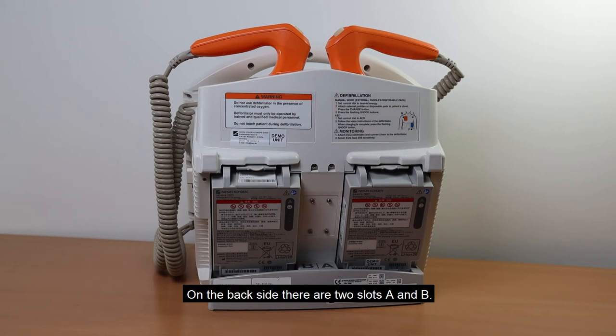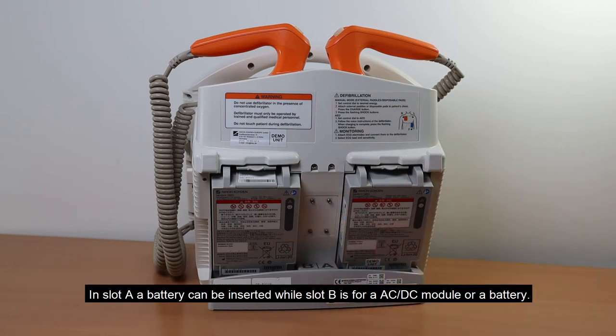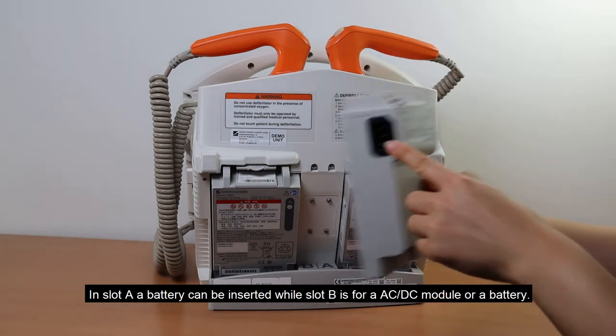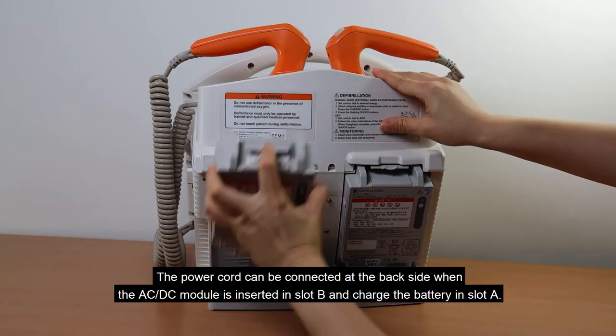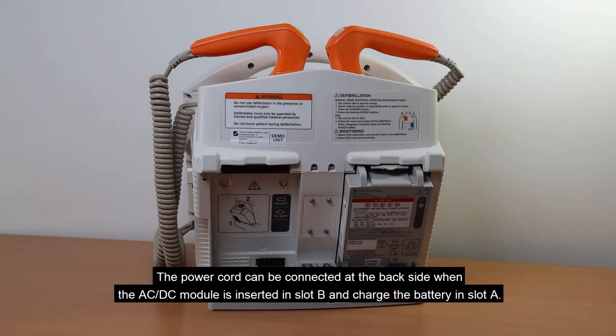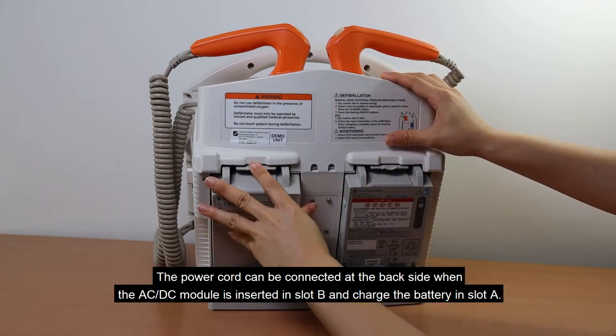On the back side, there are two slots, A and B. In slot A, a battery can be inserted, while slot B is for an AC-DC module or a battery. The power cord can be connected at the back side when the AC-DC module is inserted in slot B, and it will charge the battery in slot A.